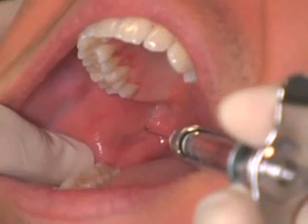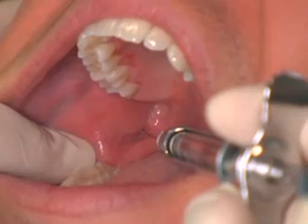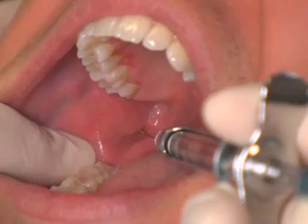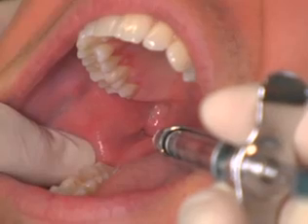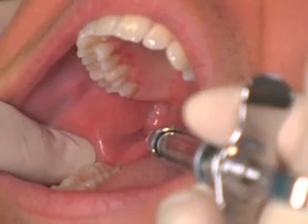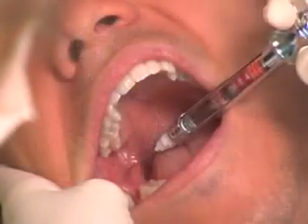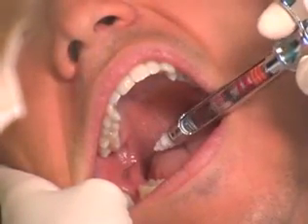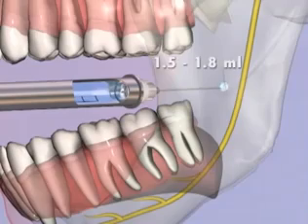The needle is then inserted and advanced slowly until bone is contacted. The average depth of penetration is between 20 and 25 millimeters, which is 2/3 to 3/4 the length of a long dental needle. Once bone is contacted, aspiration is performed twice, and if negative, 1.5 to 1.8 mL of local anesthetic is administered slowly.